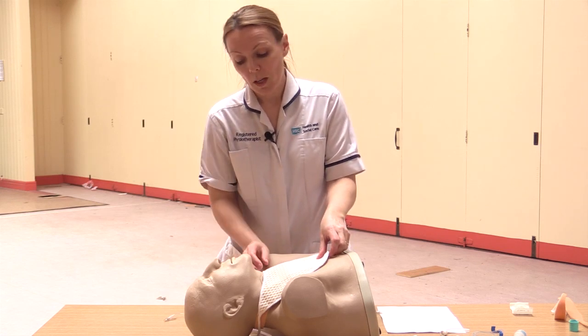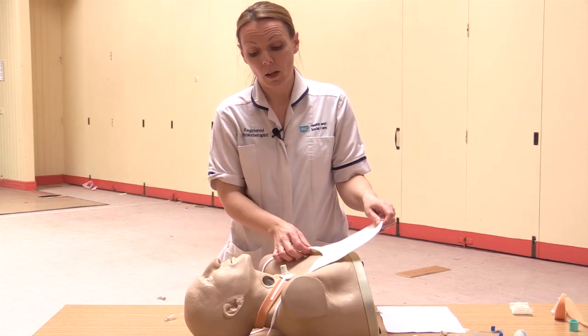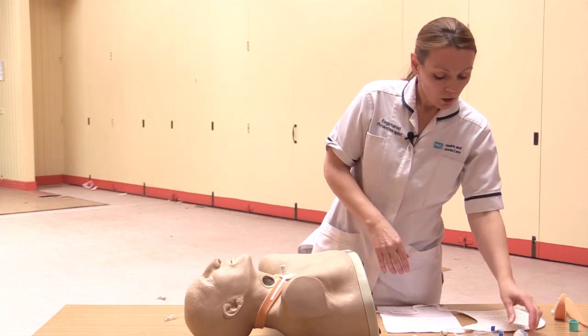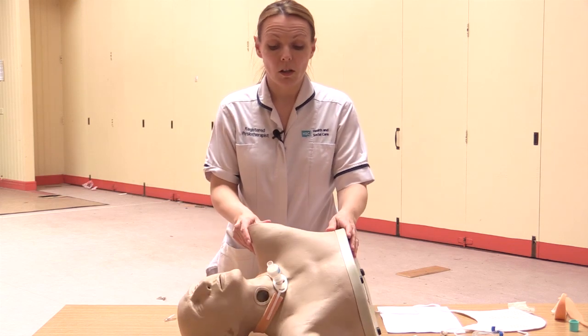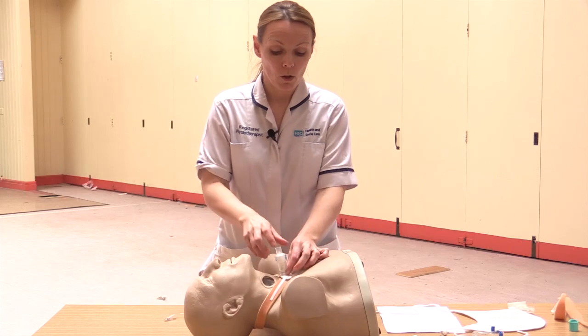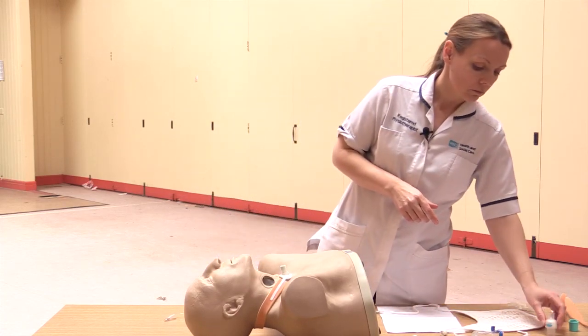So just always be aware that the neck is exposed, and that you definitely know that they're a tracheostomy patient. There are other heat moisture exchangers that fit directly onto the tracheostomy tube. So it's just to be aware that you know of them. Again, it just heats the air, filters it and moistens it.